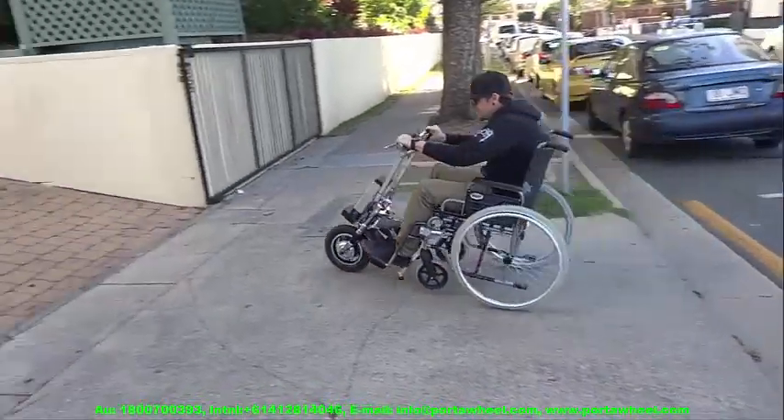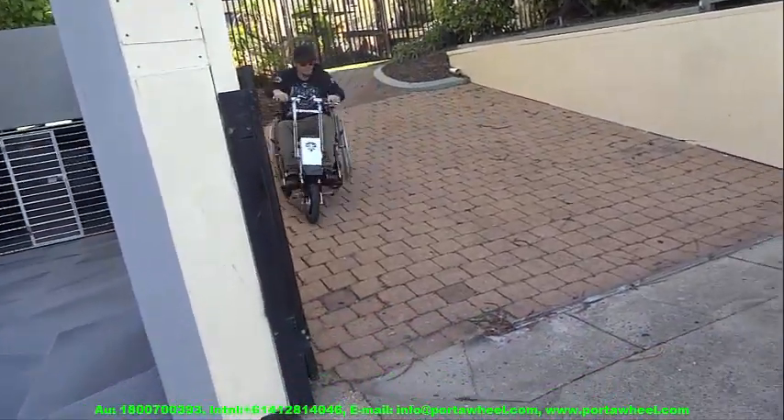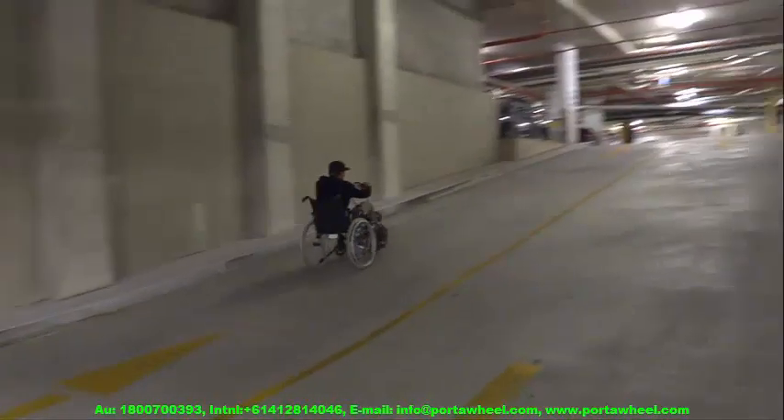Your PortaWheel is ideally suited for outdoor use, but due to its very tight turning circle it performs very well for indoor use as well, especially in shopping malls.